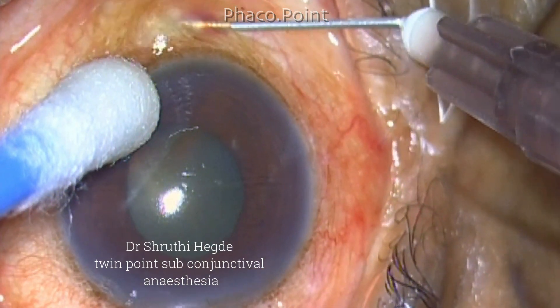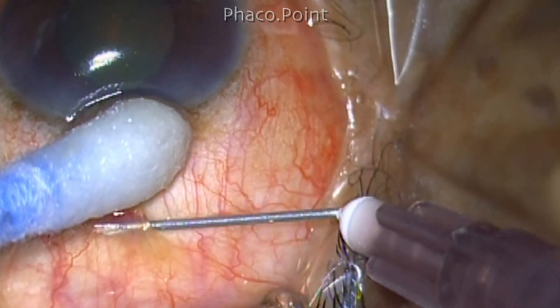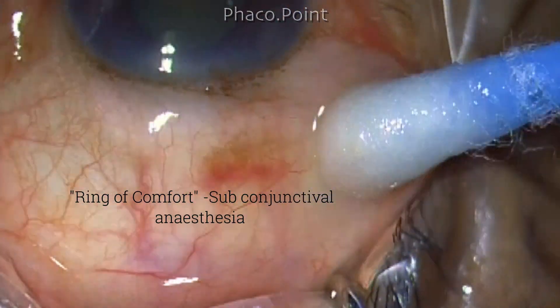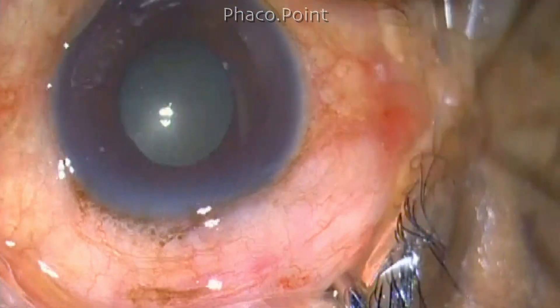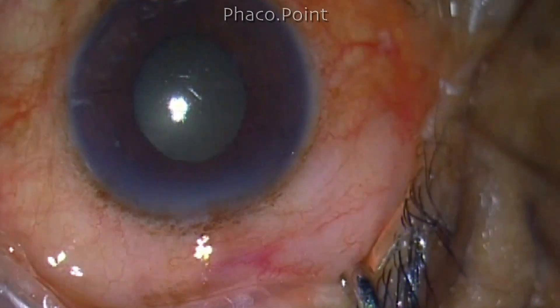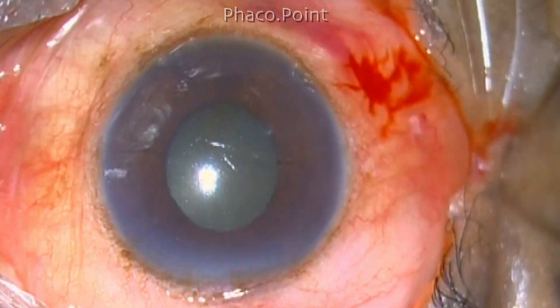Using a bent 26-gauge needle, a small amount — just 0.1 to 0.2 ml of lignocaine — is injected at the superior and inferior limbus. The anesthetic is then spread all around 360 degrees; this is called the 'ring of comfort,' a term coined by my colleague. I believe it travels along the anterior ciliary vessels through the sclera and anesthetizes the ciliary body very well. Even after a block, if a patient experiences pain, subconjunctival supplementation works very well.